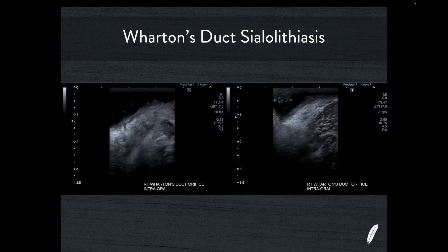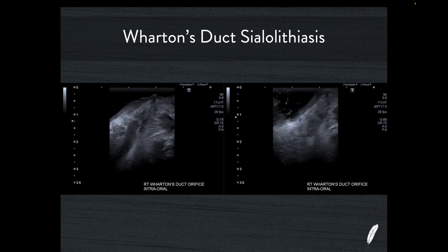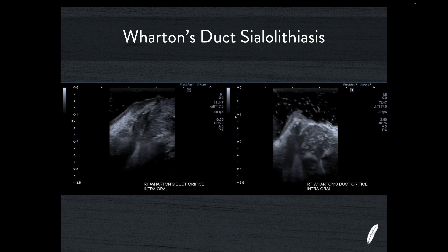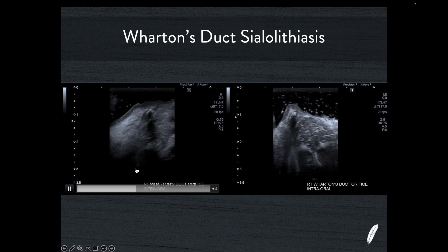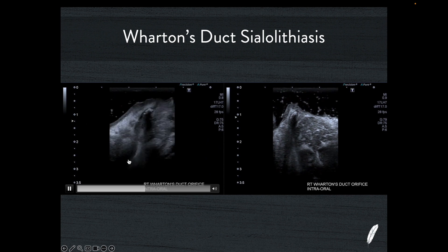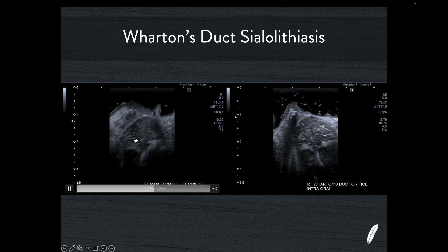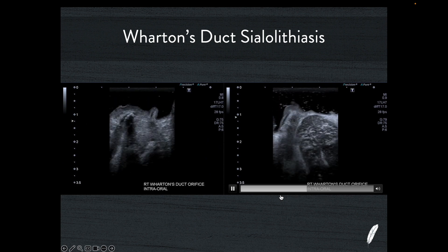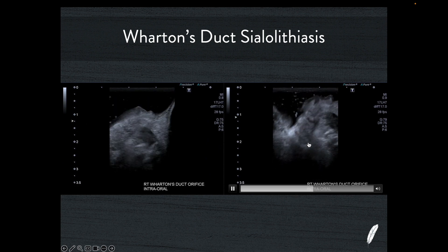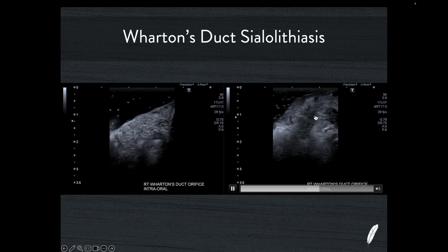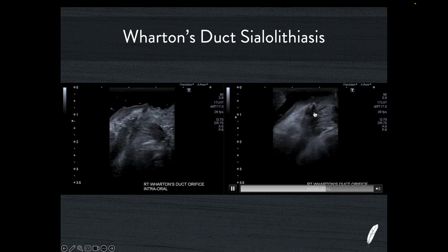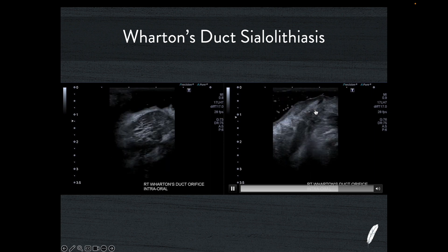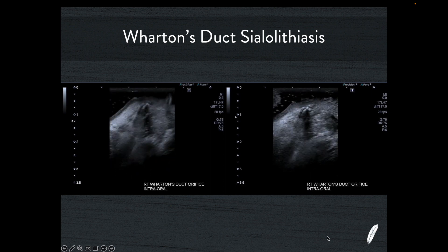Here's another case where I've seen sialectasis. You can see the dilated duct coming all the way up from the bottom, and at the terminal end you can see at least one calculus — maybe a couple of calculi — sitting in that terminal end.